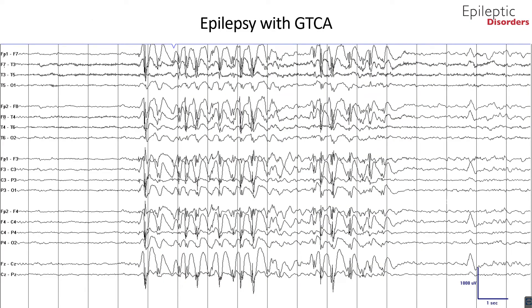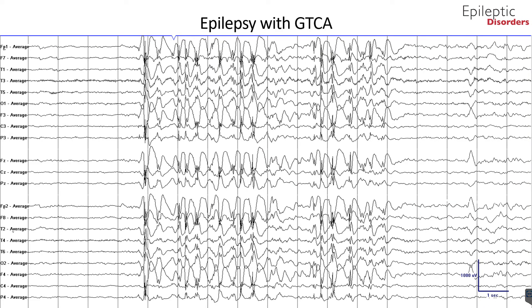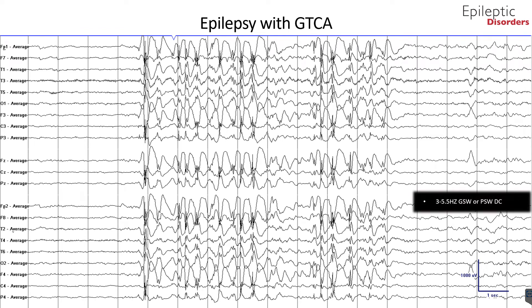This is a bipolar montage of a 22-year-old male showing 3 Hz generalized spike and poly spike-wave discharges that appear maximal in amplitude in the frontal regions. This patient had epilepsy with generalized tonic-clonic seizures alone. The average montage of the same patient similarly shows 3 Hz generalized spike and poly spike-wave discharges maximal in the frontal regions.